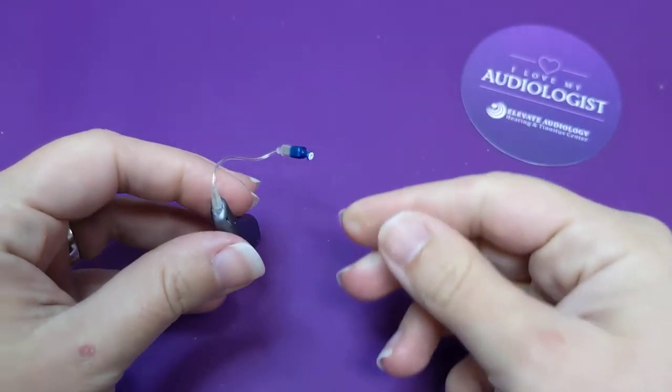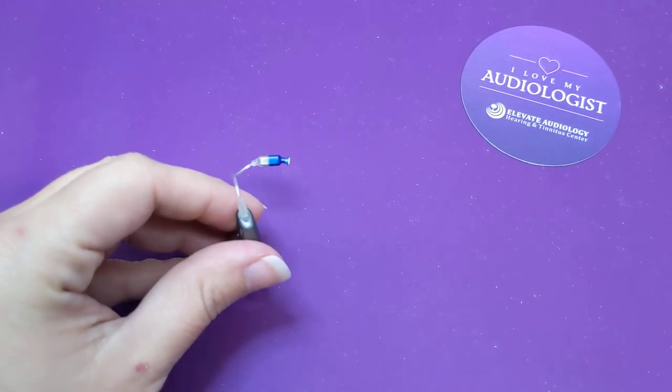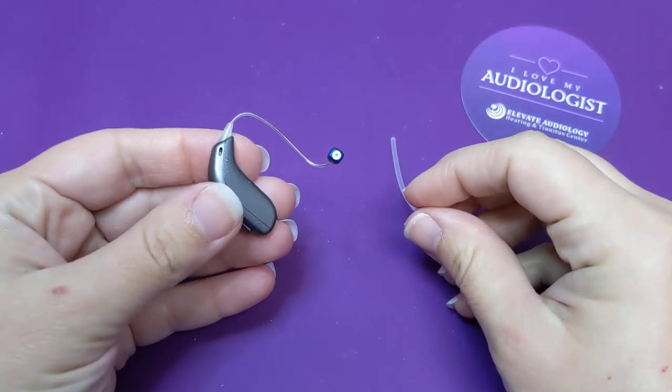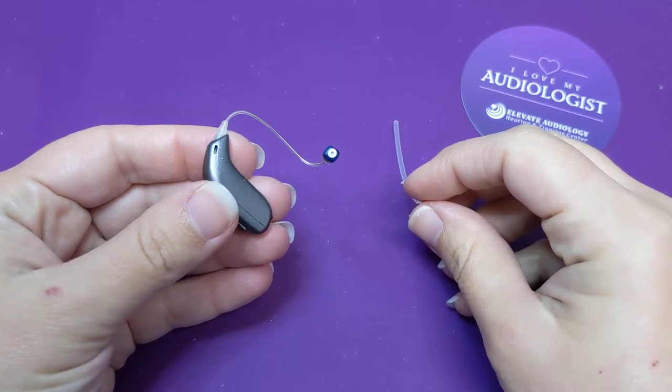All right, on this video we're going to show you how to put an anchor or a sports lock on an Oticon right receiver in the ear hearing aid.